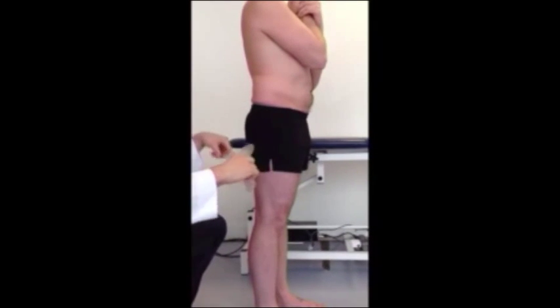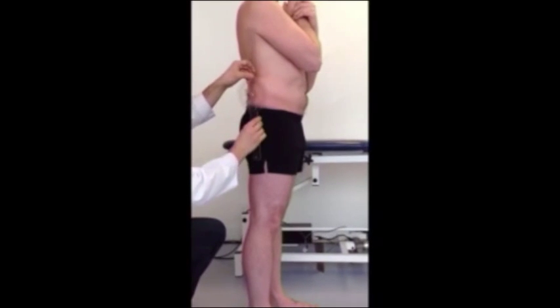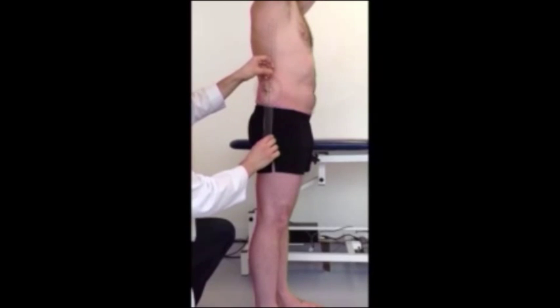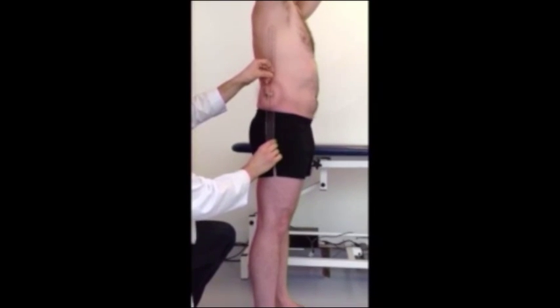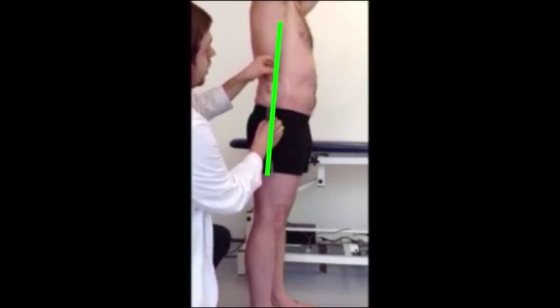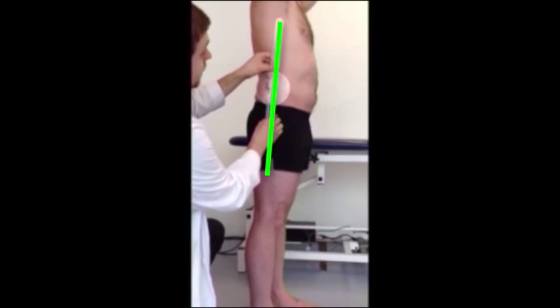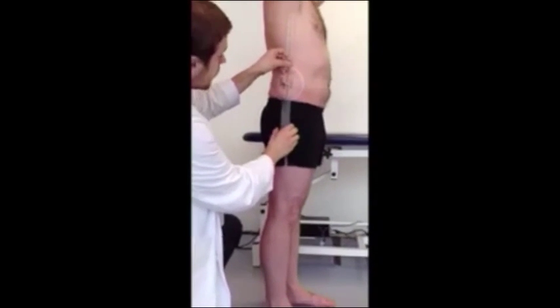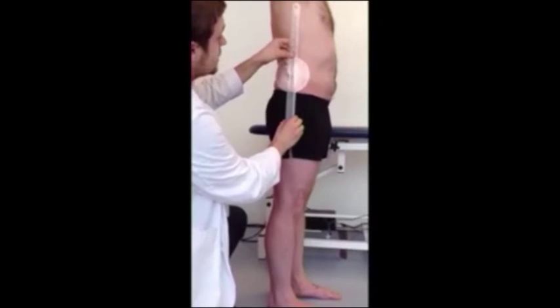So I'm going to place the goniometer, the stationary arm bisecting the ASIS and PSIS, the axis on the iliac crest, and then the mobile arm is going to be at the mid-axillary line, so in the middle of the armpit. Alright, and now I'm just going to ask Nicholas to bend forward.